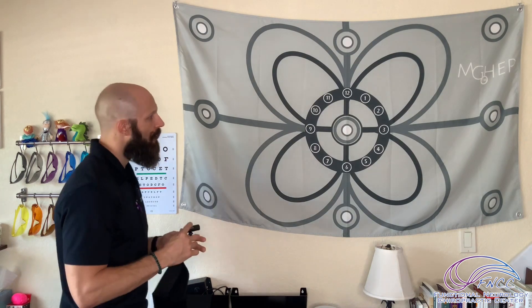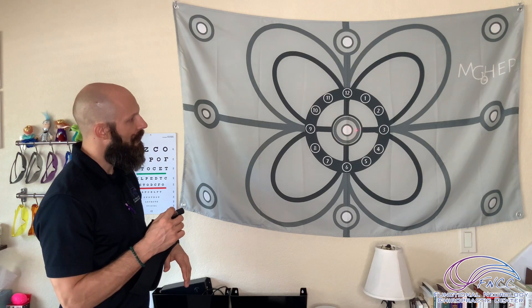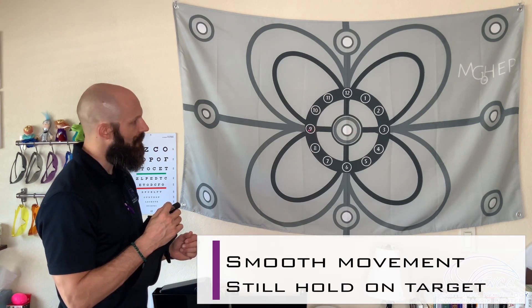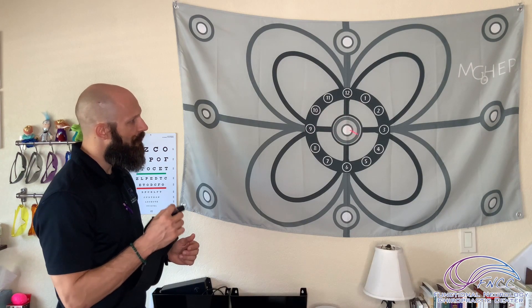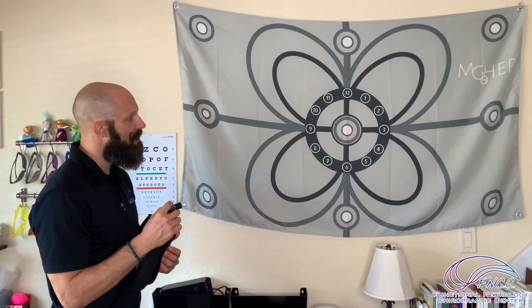We typically place this on a patient's head and have them focus the laser on different targets or different movements on this map. We can have them move in straight lines — we want to see a smooth movement with a nice still hold inside the target. We can go vertical or horizontal, and then we can go at angles. We call this our clock face.